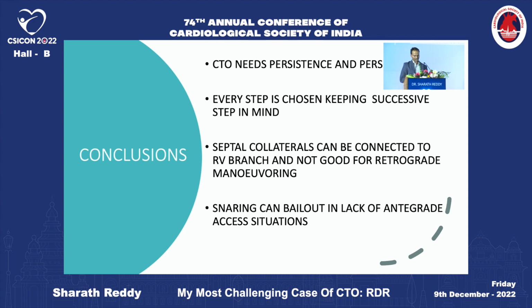Septal collaterals can be connected to the RV branch, and these are not good for retrograde maneuvering. Snaring can bail out in lack of antegrade access situations like this case.